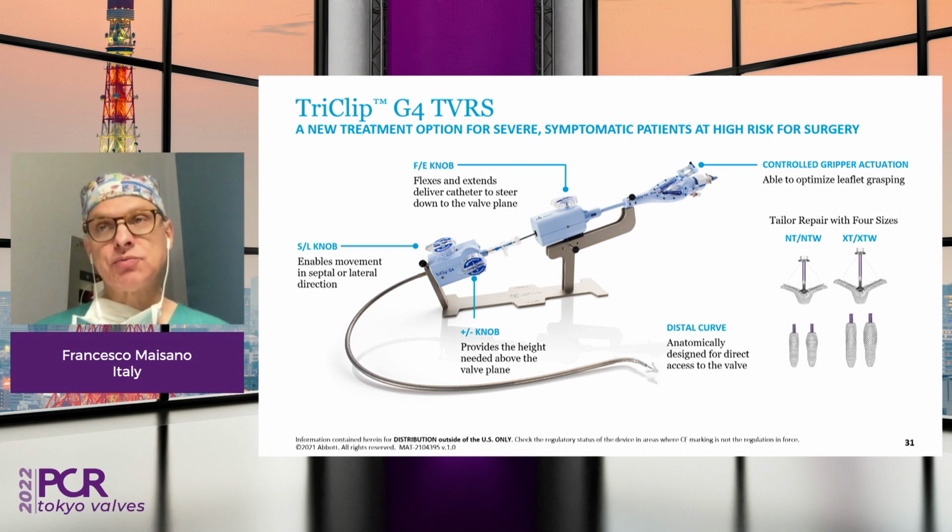Tricuspid is actually much more difficult because of imaging limitations we will see very soon in the case, but also because of the complexity of the anatomy. As you have seen, this particular patient is a not uncommon patient with a 4-leaflet configuration. But even in a 3-leaflet configuration, the line of coaptation, different from mitral, which is only one line, is a semicircular line. In this case, it's like a Mercedes-Benz, a 3-line configuration if there are 3 leaflets, and a 4-line configuration if it is a 4-leaflet.